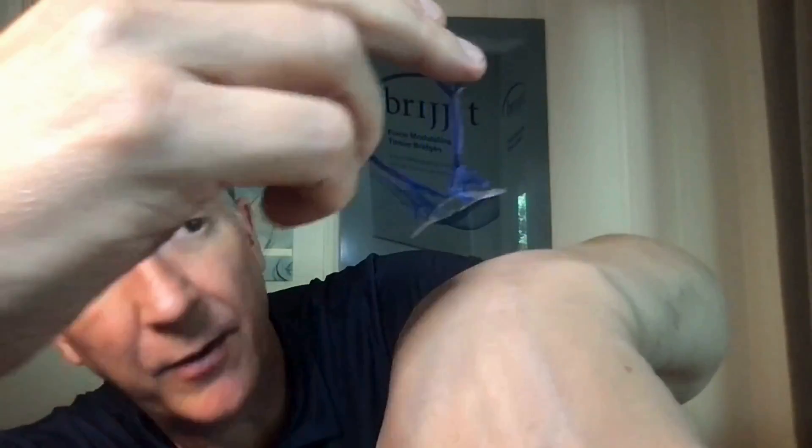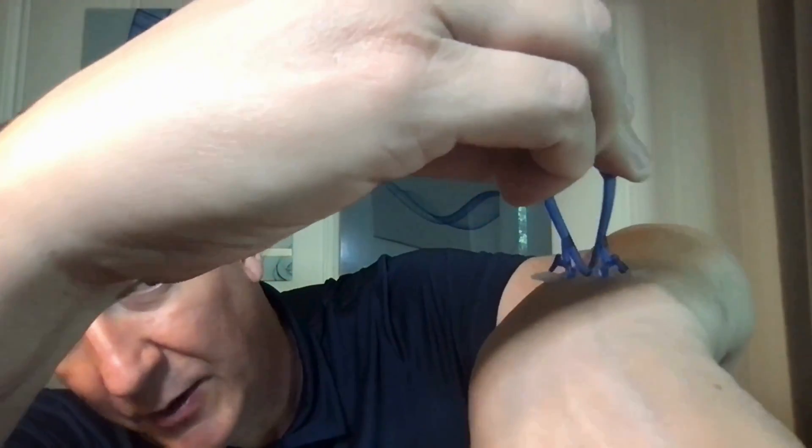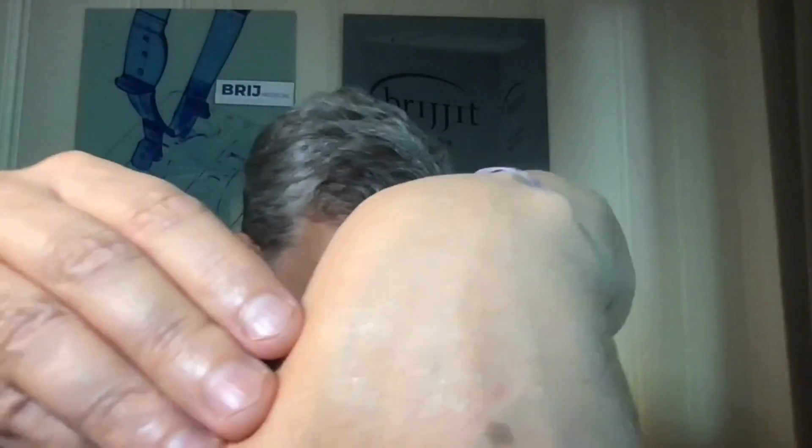I can put it on an area that might be a little easier to see. So again, I'm going to click, roll — let me go where it's a little flush here. Here we go. I'm going to squeeze, press, let go. And as it does, it'll pull that in. And now it's on. If you look at it now, you might be able to see that the tension is off — you can see it averted and lifted up in the middle.